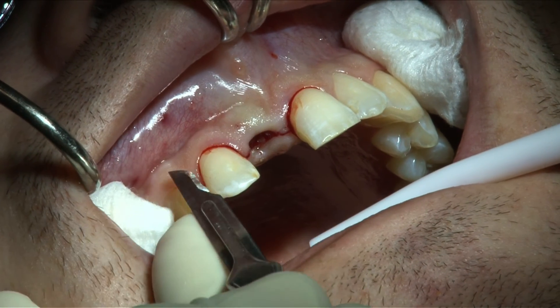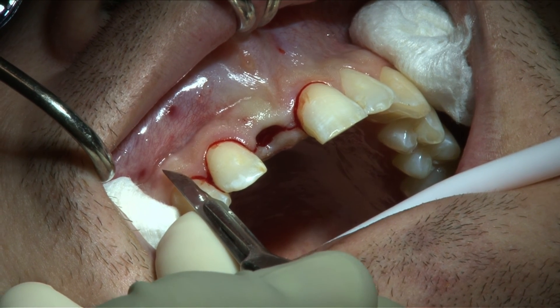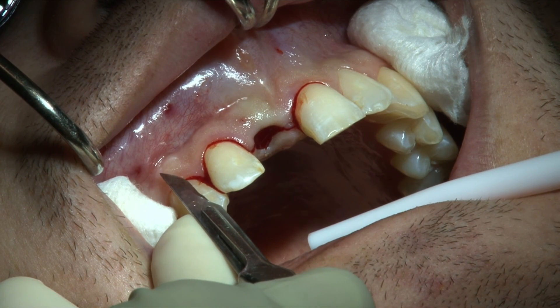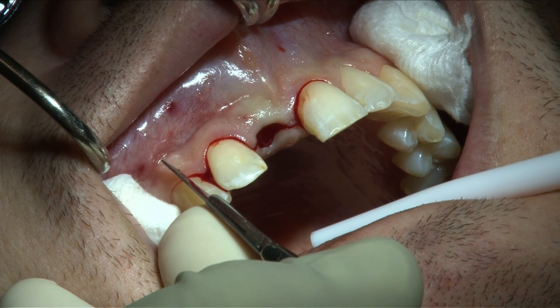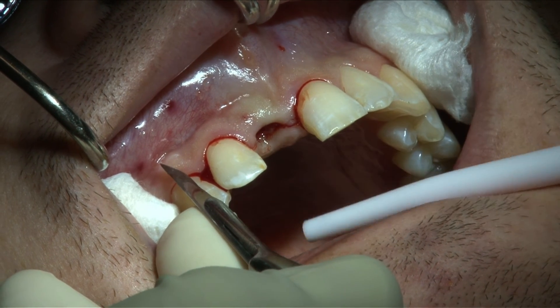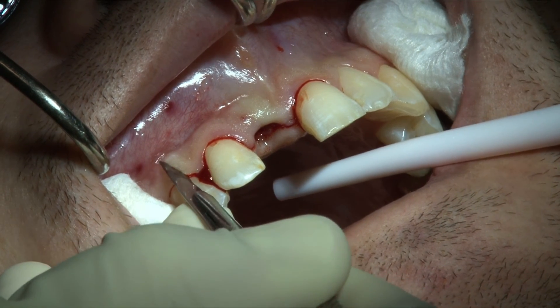A vertical releasing incision is required on the mesiofacial aspect of the right canine. In the keratinized gingiva, the incision is beveled at 45 degrees to the surface of the soft tissue to allow the flap edges to be well adapted when the wound is closed and sutured. This reduces the risk of scar formation.